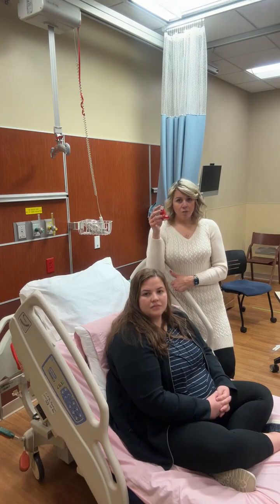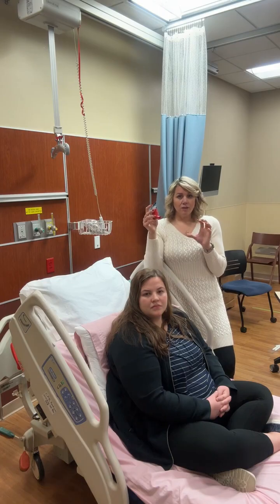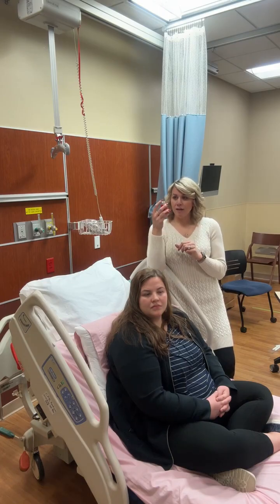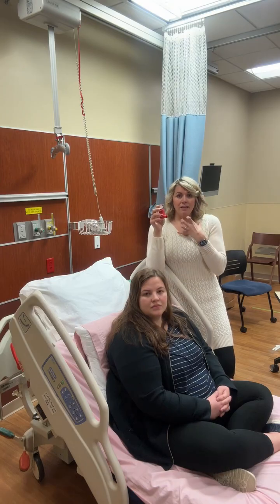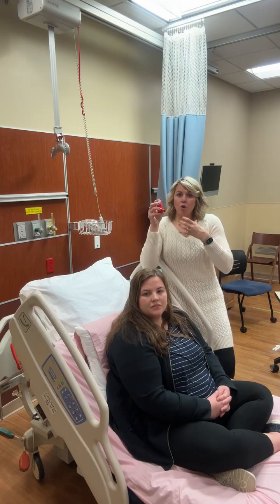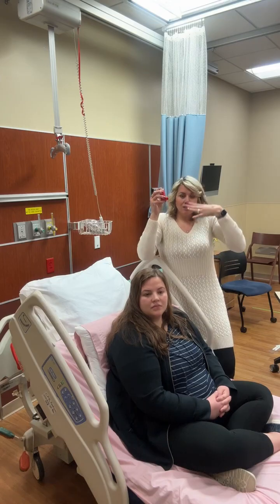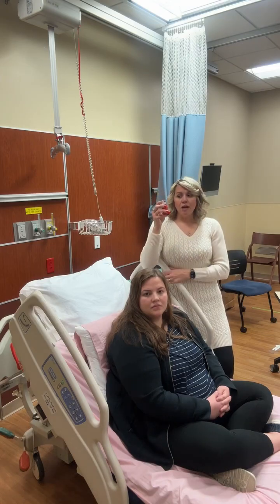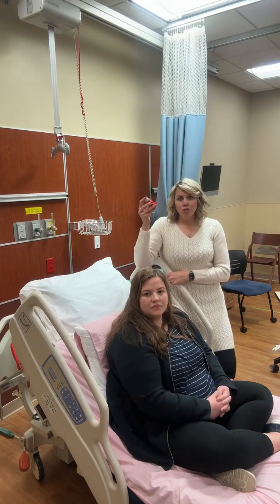A coordinated breath hold is basically when someone takes a short breath first, just a little one, then sticks this in their mouth and pushes down the canister, and when they push it down, they complete that inhale. So they take a small breath to open up their airway a little bit, push down the canister, and then breathe in the rest of the way so that the medicine can deposit all the way deep.